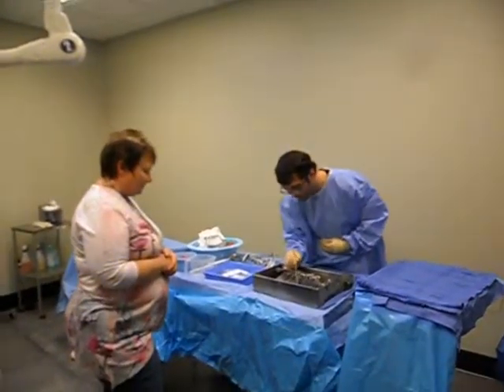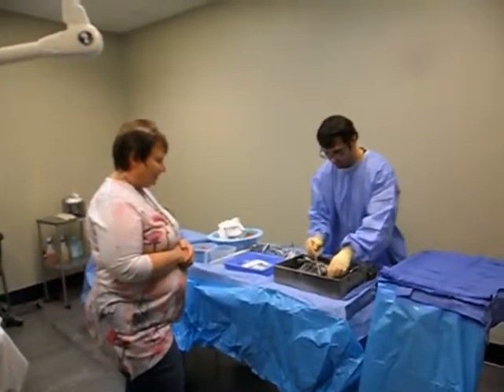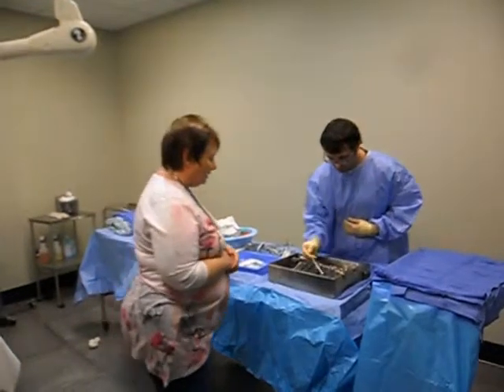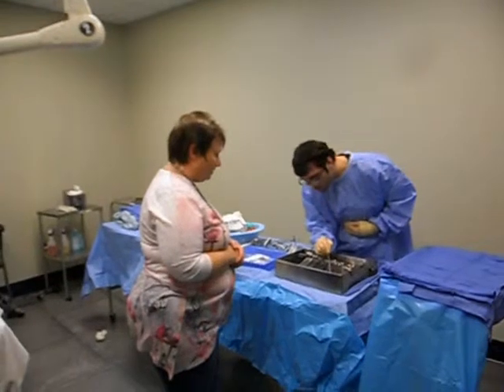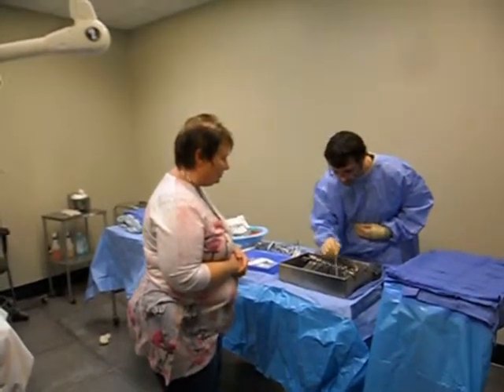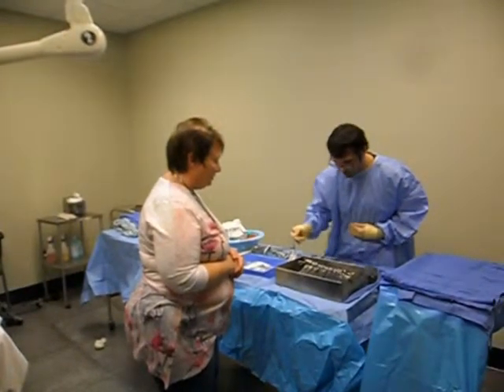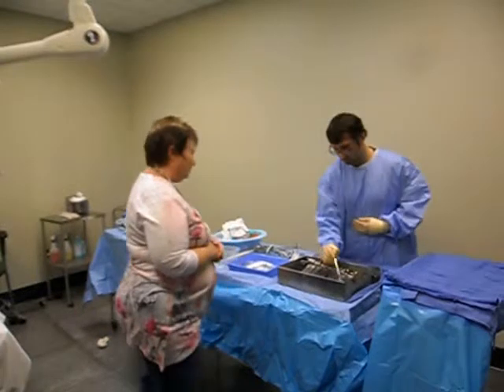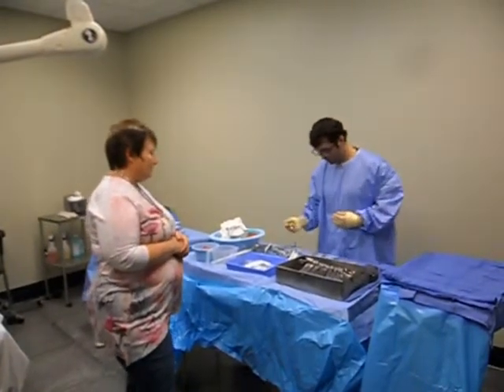Alice's, 1, 2. Babcock's, 1, 2. Leahy's, 1, 2. Tonsil, 1. Long Alice's, 1, 2. Long Coker, 1. Curved Doyens, 1, 2. Straight Doyens, 2. Sponge ring holder, 1 short and 1 long. Needle holders, 1, 2. Knife handles, 2 short and 1 long.